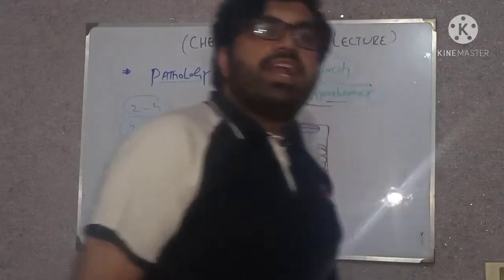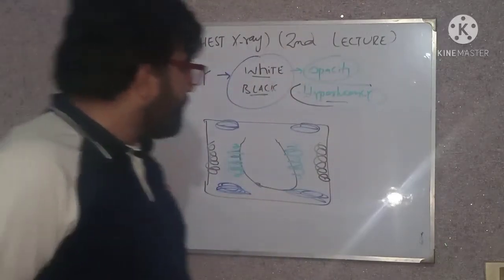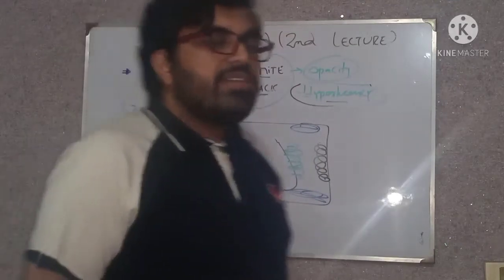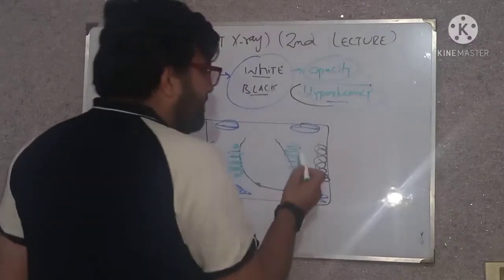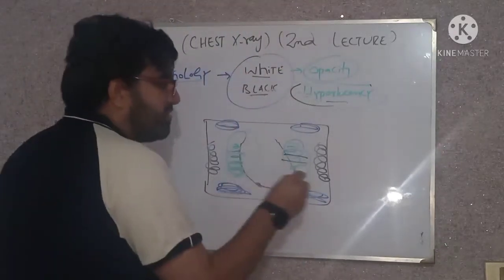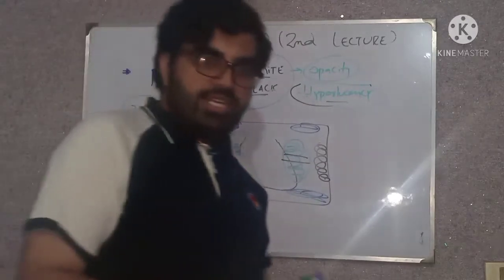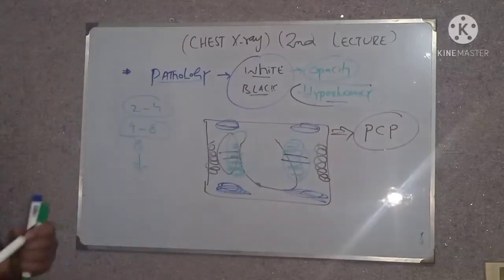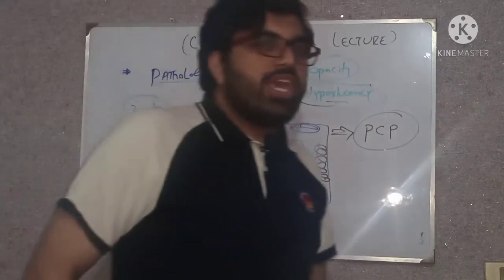If you can locate the lesion properly, you can diagnose the case very quickly. A patient diagnosed with HIV, CD4 count less than 200, with cough and fever for the last four days — X-ray shows bilateral opacities predominantly centrally in the perihilar region. The distribution of the lesion around the hilum in an HIV patient with cough and fever — the answer is Pneumocystis pneumonia (PCP), also known as Pneumocystis jirovecii or Pneumocystis carinii pneumonia.